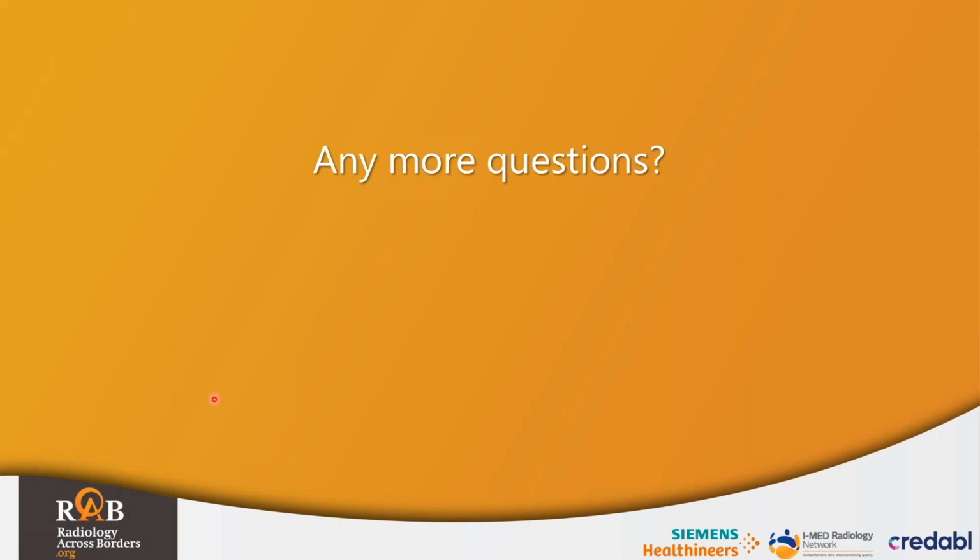Okay, so Georgia Taylor has asked, when you mentioned you can change other settings before changing the Hounsfield unit trigger for a CTPA, what would you suggest changing before changing that Hounsfield unit trigger? So again, it depends on what system you're on, but if you've got a post-bolus delay or a post-trigger delay that you can control, I would change that, because if we're monitoring every 1 second or 1.5 seconds, the rate at which the contrast enhancement is moving is really quick.